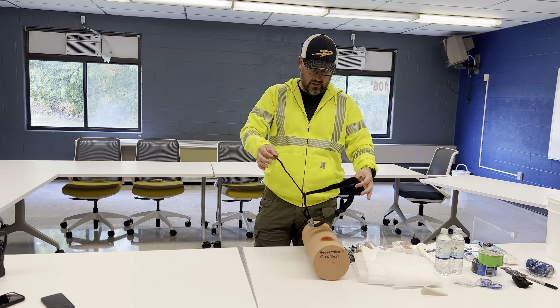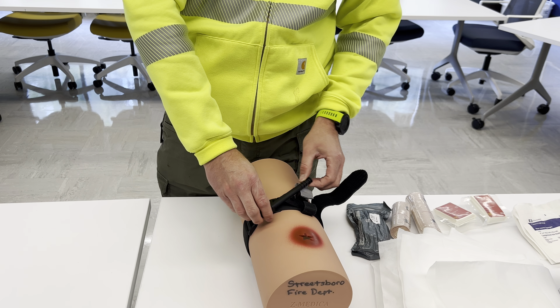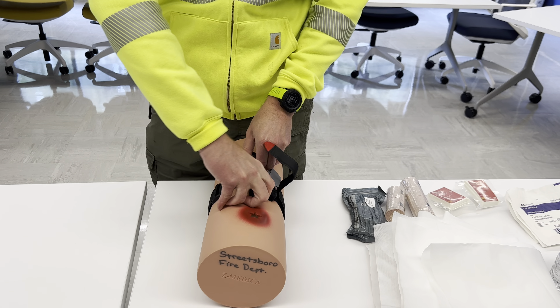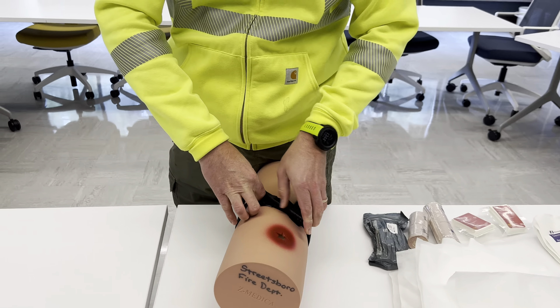Really try to tighten it down as much as you can, then wrap it around the leg or arm. In this case I can get maybe one or two fingers in — it's starting to get really tight, which is good. After that, you want to start turning the windlass. It doesn't matter which direction — it will still tighten and restrict. With each turn you can see it getting tighter and tighter. When you have it as tight as you need, lock it in at the top and close the gate. Depending on room available, you can thread it through — varies for a large leg versus a small arm.